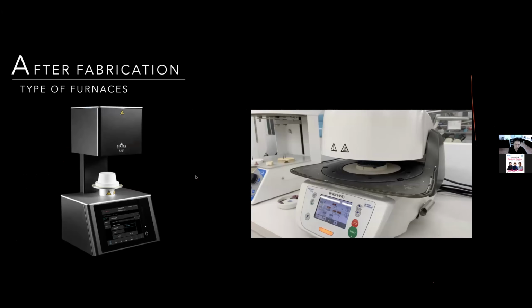And I want to tell you another interesting and important thing about your furnace, because in the past we didn't need to care about our furnace. The Ivoclar furnace is very nice for layering the restoration, but nowadays for zirconia or monolithic zirconia or big volume zirconia it is not very good. So if you want to use this type of furnace to bake your restoration, you must be very careful.